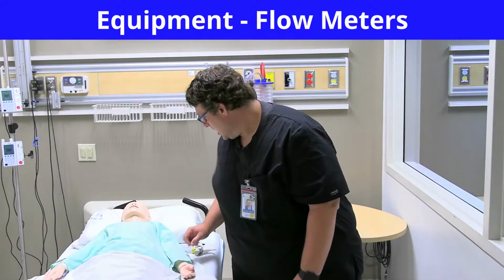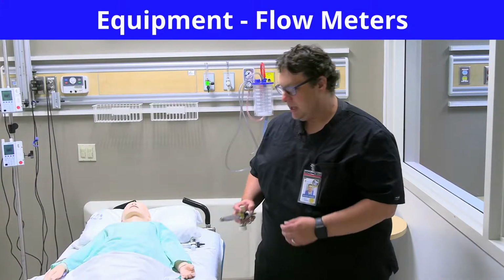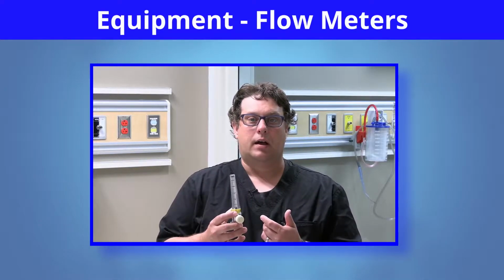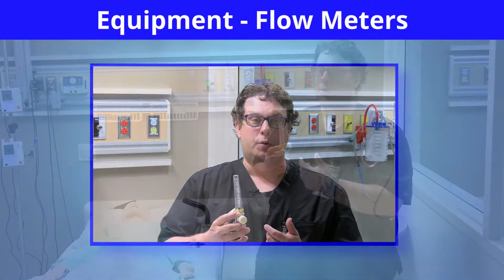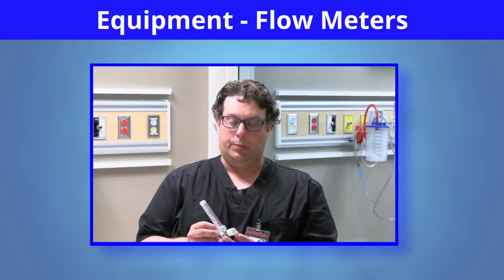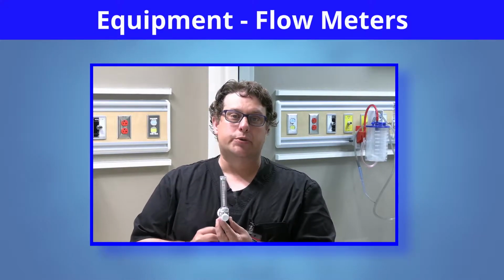wards. In pediatrics, because we are trying to minimize the toxic effects of oxygen, we also even have low flow meters. This one here that I'm holding right now is a 5 liter per minute flow meter. We also have available to us a 3 liter per minute flow meter. And then we have our ultra low flow meters, or our Matheson's flow meters, that can be a little bit more specific level of oxygen that you want to deliver, from 0 to 200 mils of oxygen per minute.